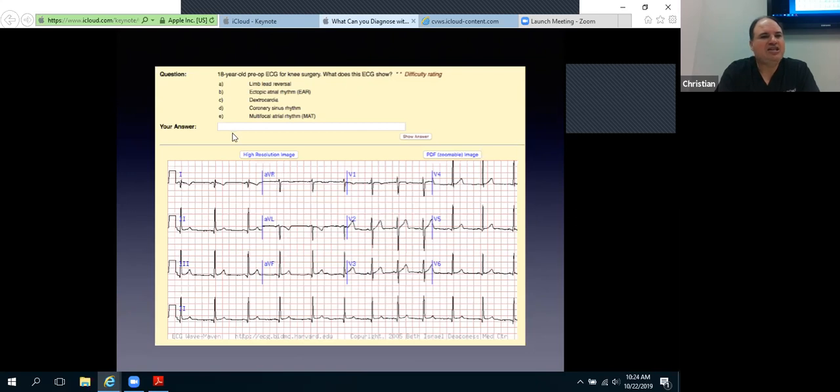Every EKG that I interpret, I first note what the rate is, what the rhythm is, what the axis is, and if there are any ST elevations present. And I sign every EKG with that interpretation every single time. The reason I do that exercise is that it forces me to commit to an interpretation, and I'm not going to miss a STEMI that's in the waiting room or anywhere around me.